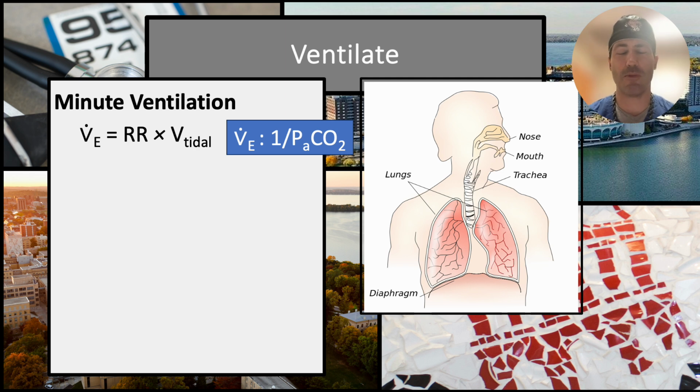In most typical ranges of patients and minute ventilation, this works out. Not always in patients with lots of dead space who are sick, or at extremes of ventilation limits, but most of the time this gives you a pretty good eyeball for changing the ventilation towards a CO2 goal.